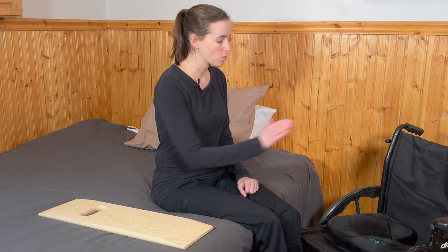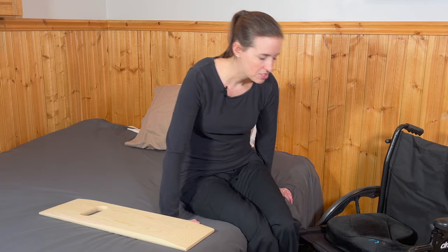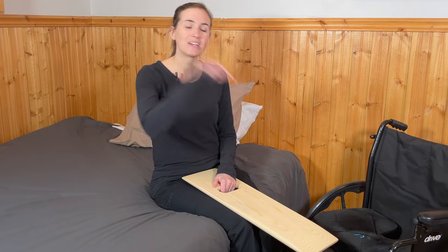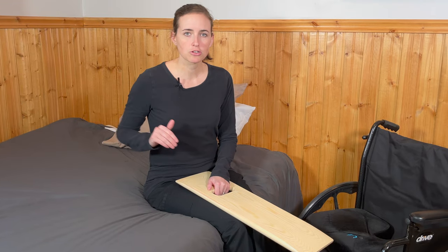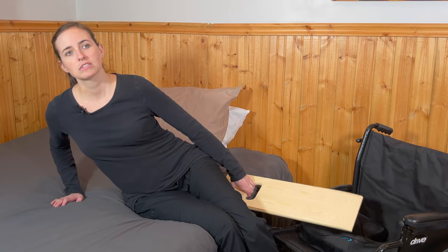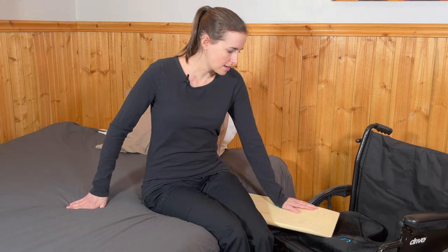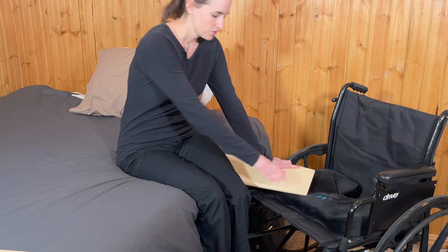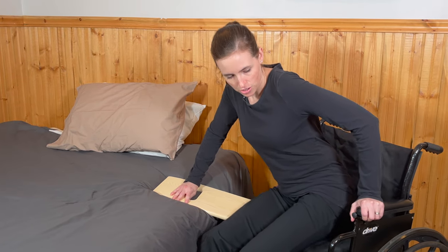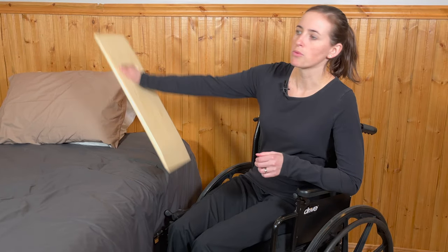Now we're going to take the same slideboard and go back to the wheelchair. Angle yourself towards the wheelchair, and know this is going to be an easier transfer because you're going downhill. Again, if your bed height is adjustable, a flat equal transfer is always safer — but this will work. Just like before, lean away, insert the slideboard under your hip and bottom, double-check that the board is secure on the seat with a lot of surface area and securely under your bottom, then push until you're back onto your wheelchair seat, and remove the slideboard.